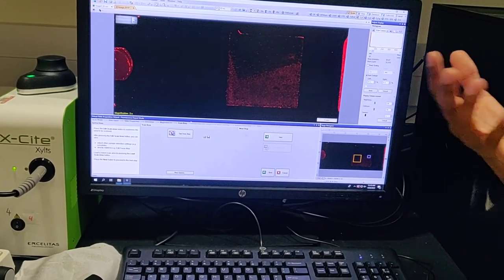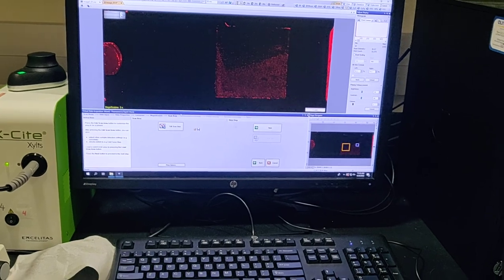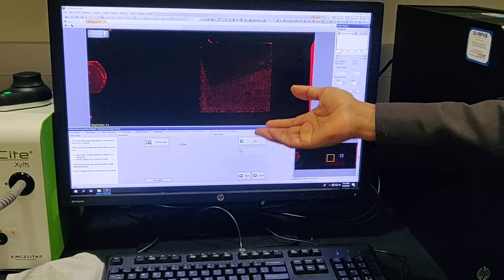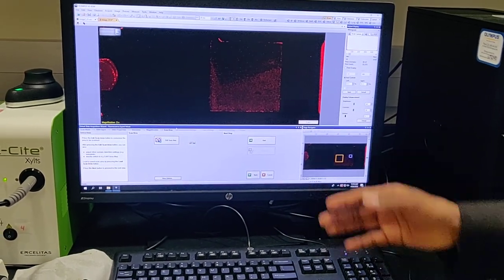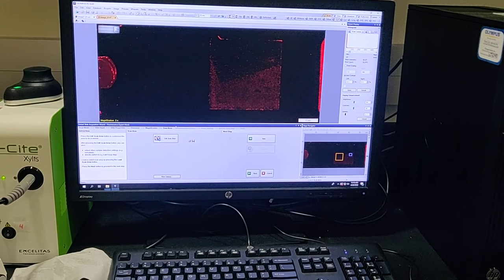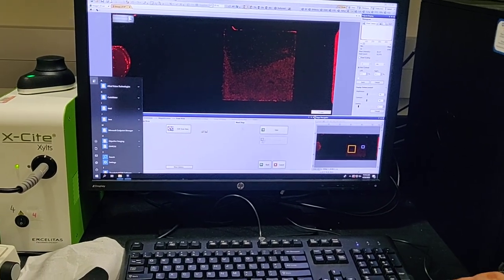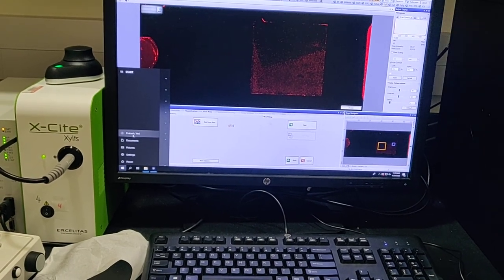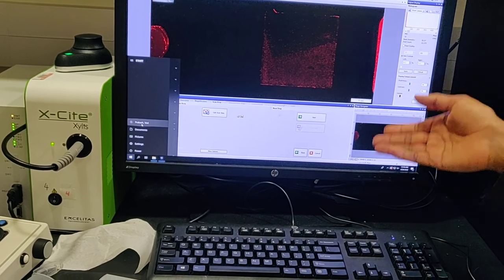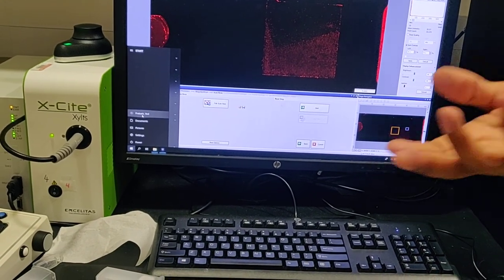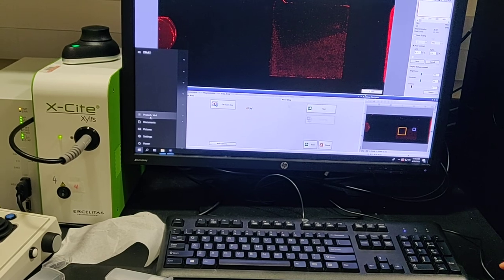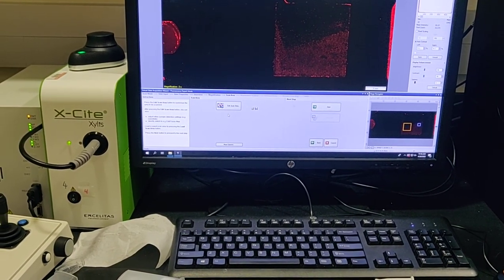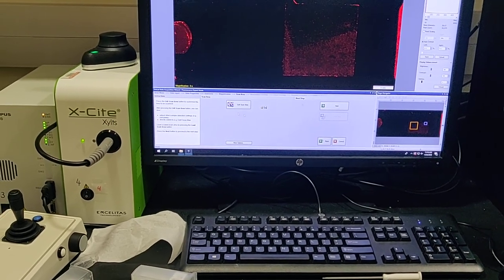If you encounter a user running the wrong protocol — lots of filter wheel noise — tell them to fix it. If it's not their login, check who is logged in: if you know them, call them right away; if not, email the imaging core. Running the wrong protocol for a long time will reduce the life of the filter wheel.